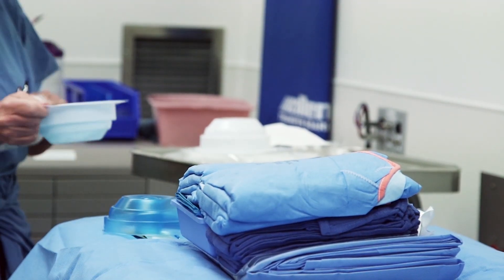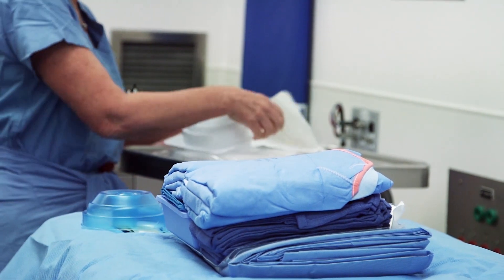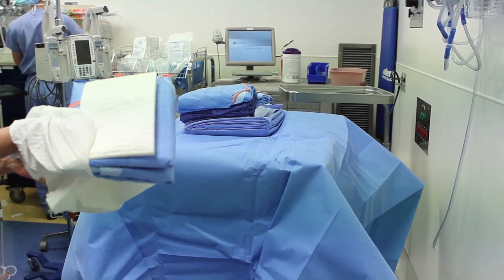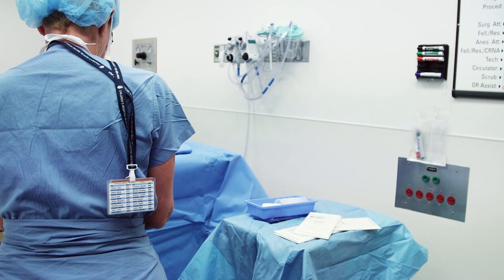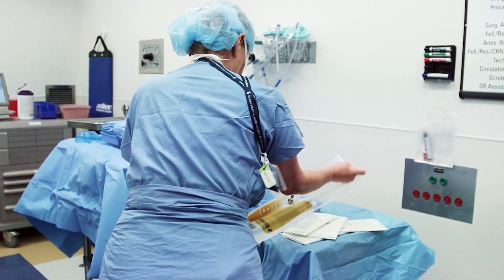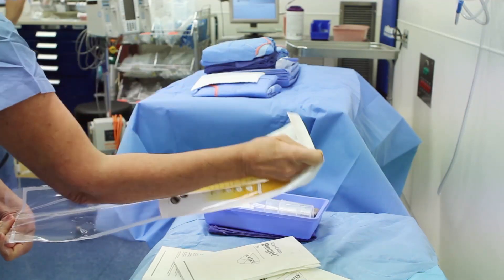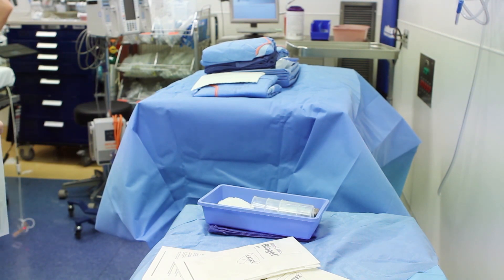Additional instruments and equipment can then be placed on this field without risk of contamination. Gowns and gloves will be obtained from the sterile field after scrubbing has been performed. As demonstrated here, antiseptics used for prepping the patient should also be placed on a sterile field. This allows members of the surgical team who have scrubbed and become sterile to prep the patient in a sterile manner.